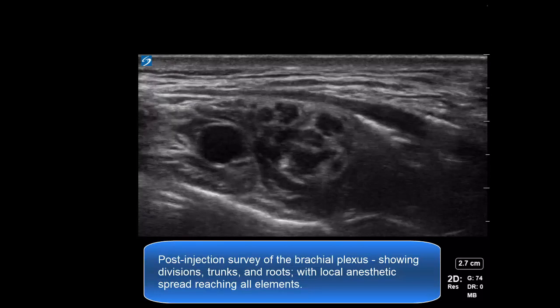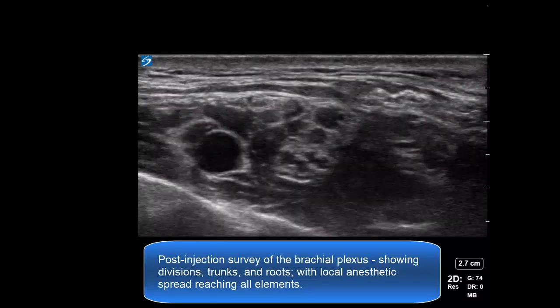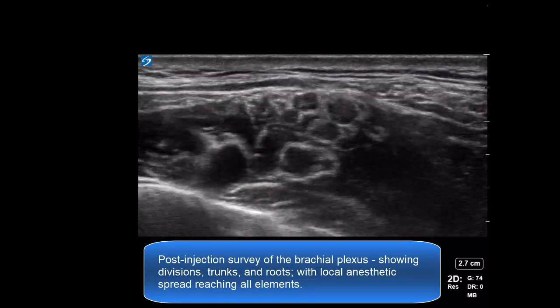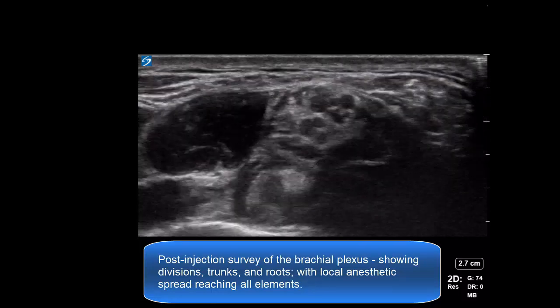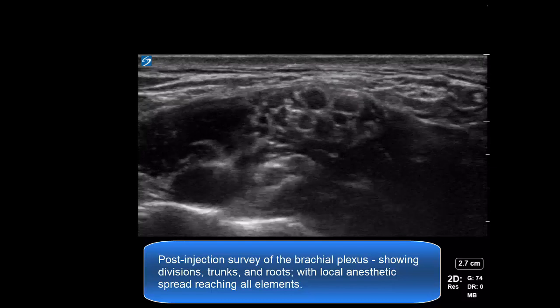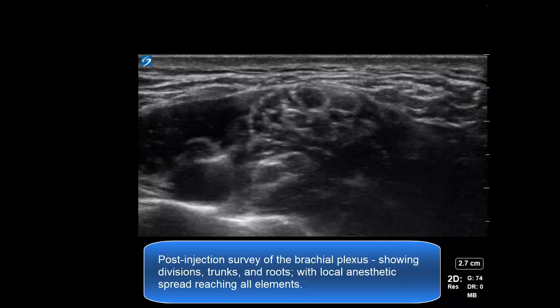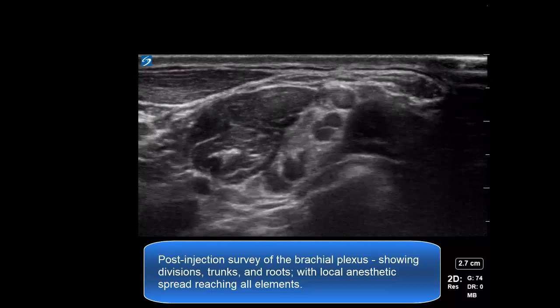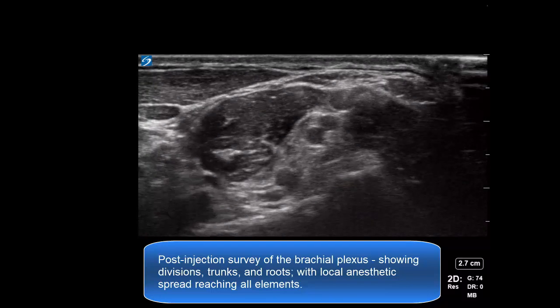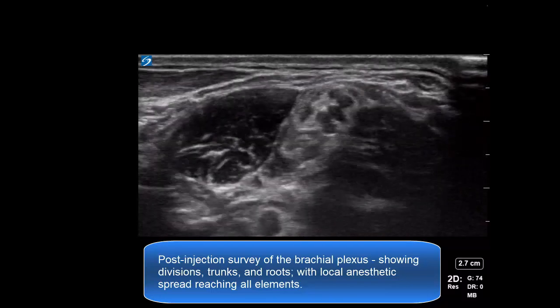This final section shows a post-block survey going up towards the roots, and all elements of the plexus are now clearly visible with local anesthetic spread around them. This confirms that the block will be successful, and that subsequent infusion should also work well.